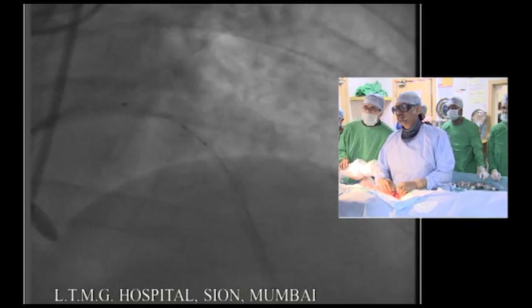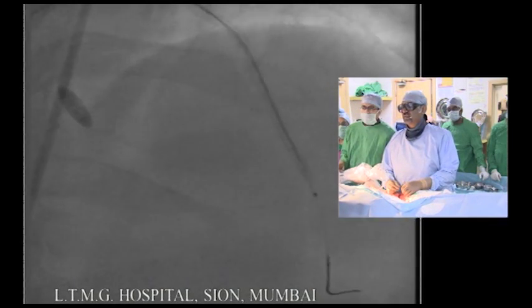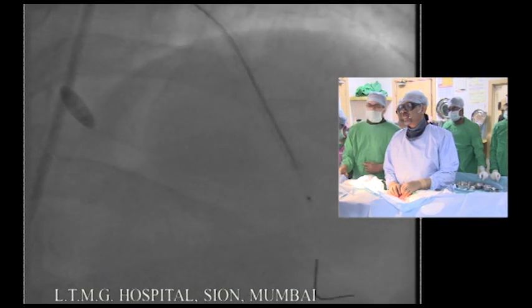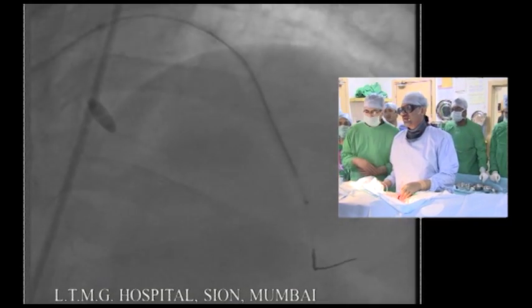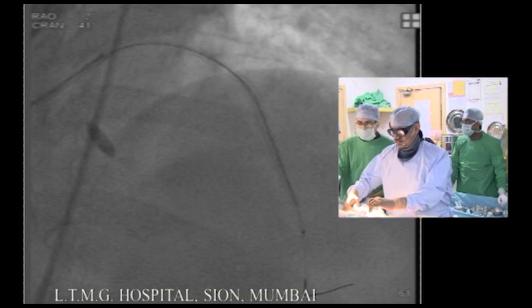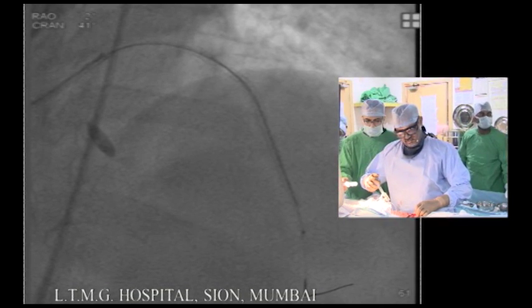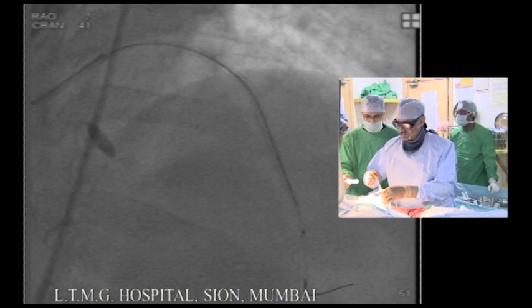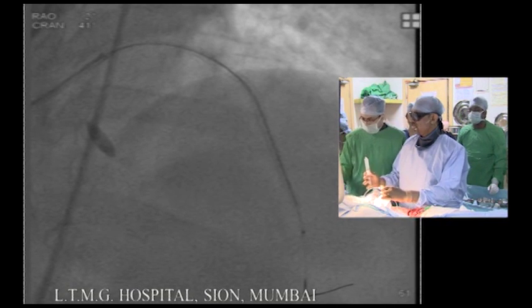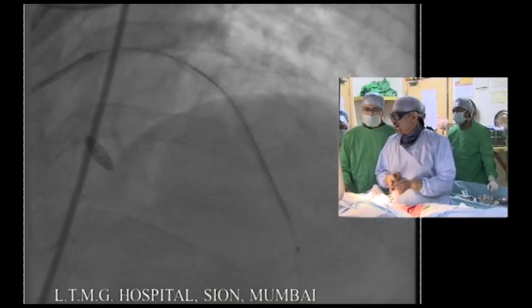But in Japan, Dr. Hamazaki, what percentage of OCT or IVUS use do you have? OCT is not so popular in Japan. As you know, IVUS is very popular. Maybe use of IVUS is 100% in Japan. I agree. Japanese insurance system is very good. I went to Japan five years ago to learn CTO, and my IVUS use jumped because they are obsessive over there. They will do pre and post IVUS for every stent.